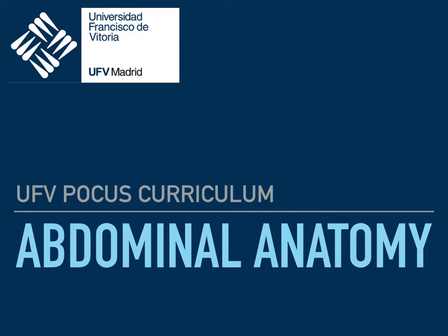Hello everyone, welcome to the second seminar for using ultrasound to evaluate the abdominal anatomy, in which we are going to talk about the great vessels and mainly the kidneys.